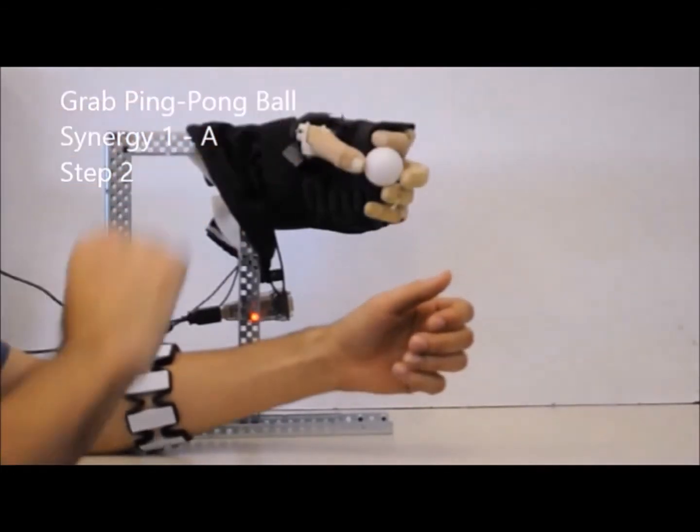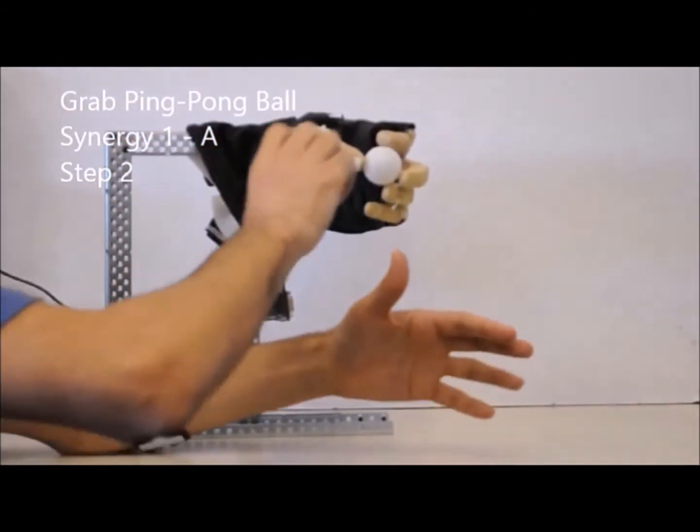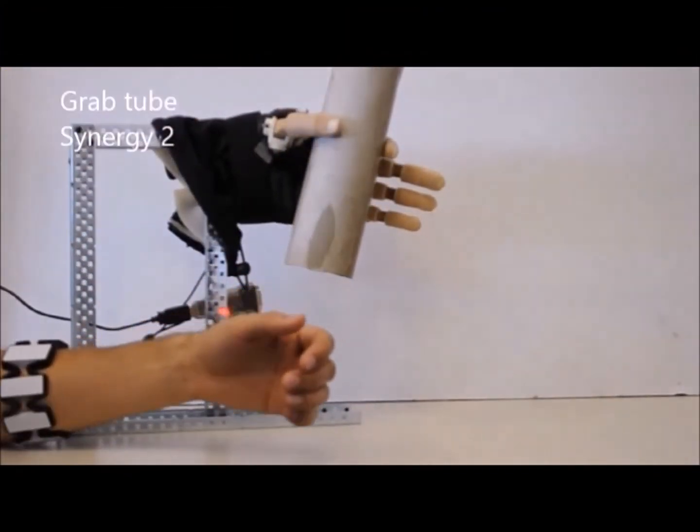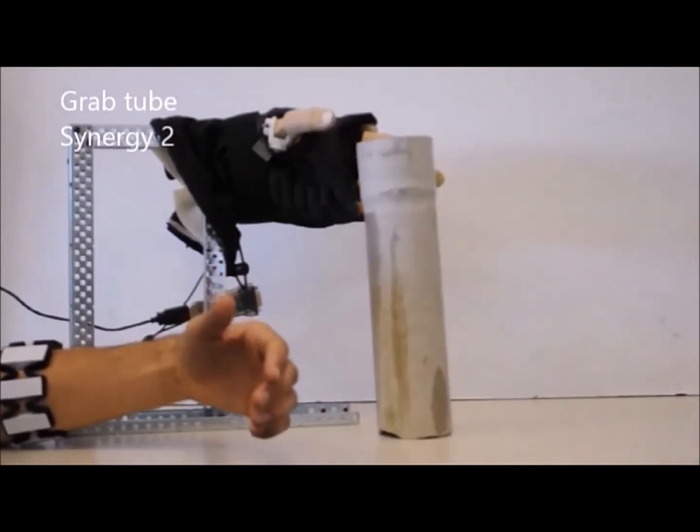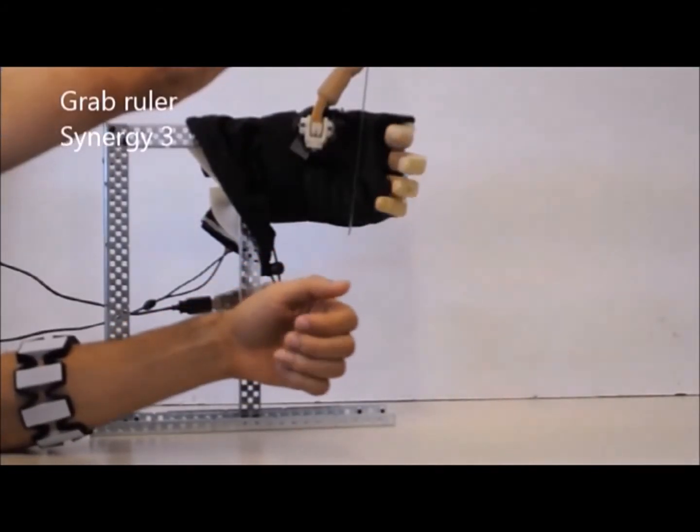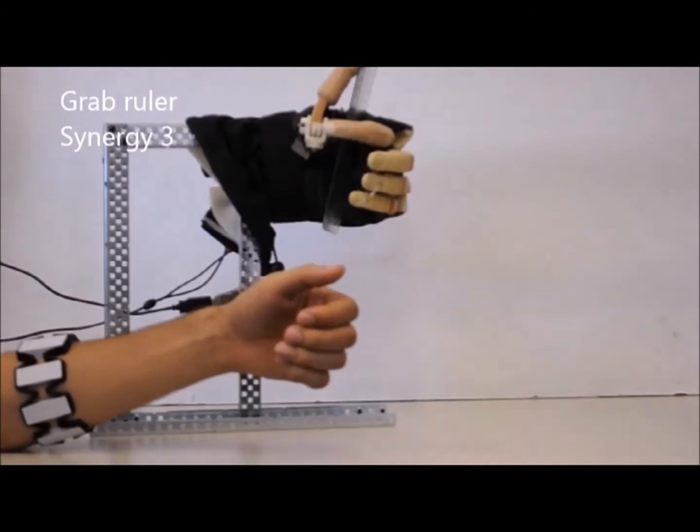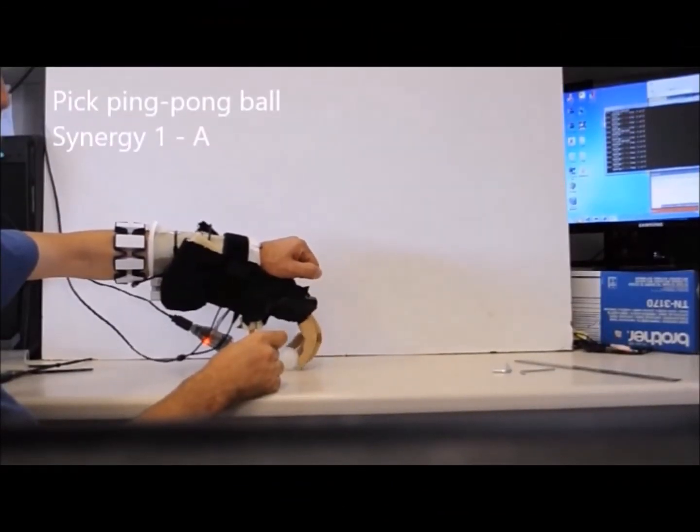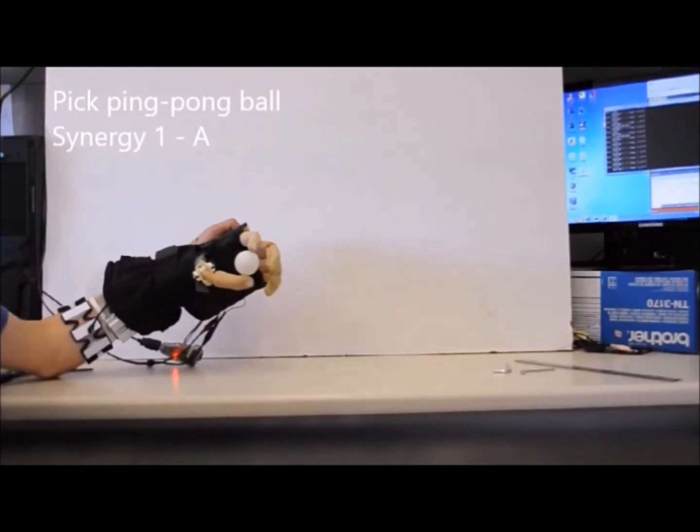In order to control the ISR Softhand with these five synergies, we utilize the gesture detection of the Myo armband: the fist gesture for closing, the finger spread gesture for opening the hand, and the wave right or wave left gestures for changing between the synergies. With this method, the user can effectively achieve all the synergies and grasp.